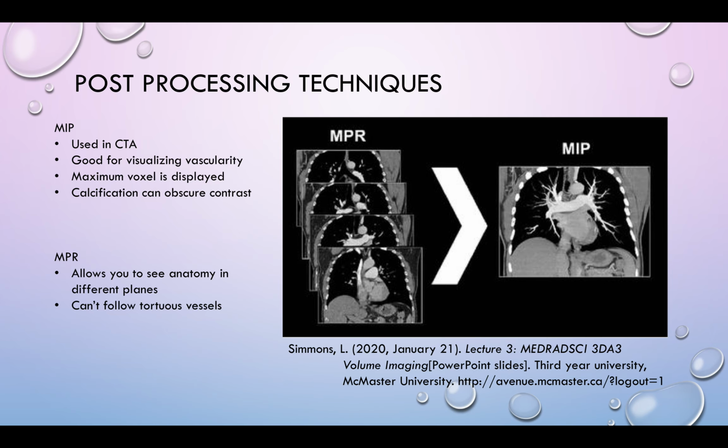Multiplanar reformats allow you to see the anatomy in the axial, coronal, and sagittal planes. However, they cannot follow tortuous vessels as this method is 2D.